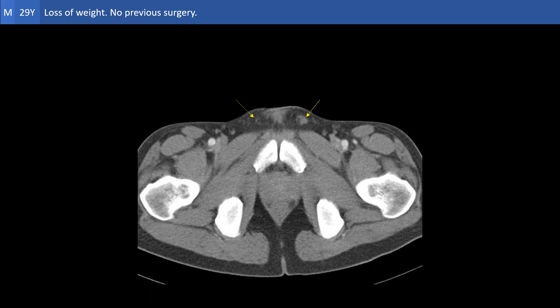The finding is the absence of the right vas deferens at its expected location. We know from the given history that the patient did not have surgery in the past. So this is in fact the clue to the organ of origin of the pelvic solid lesion, which is most probably malignant neoplasm of the right undescended testis.